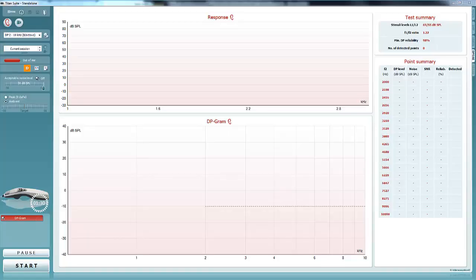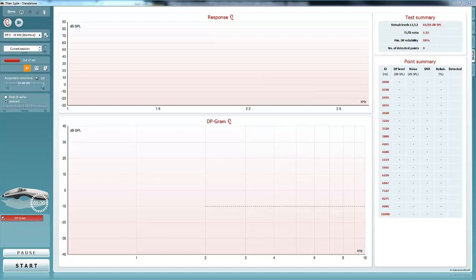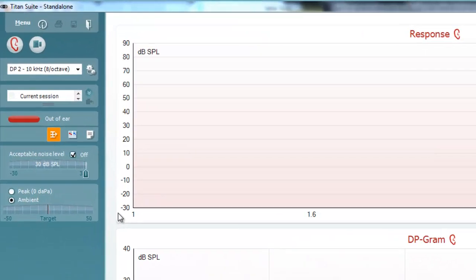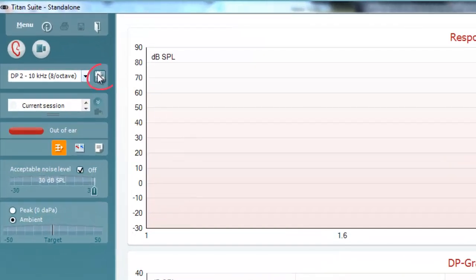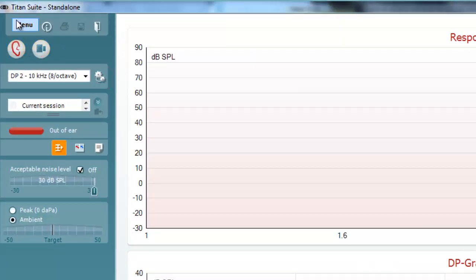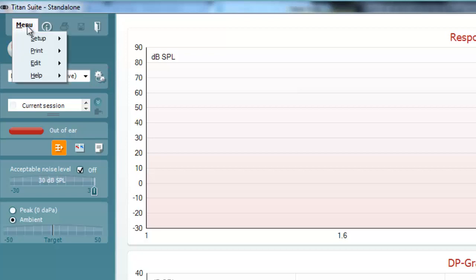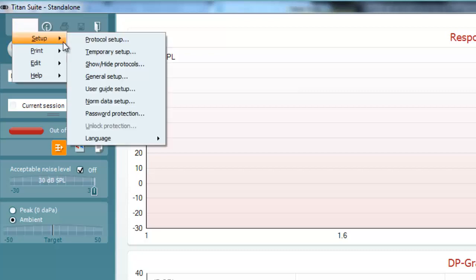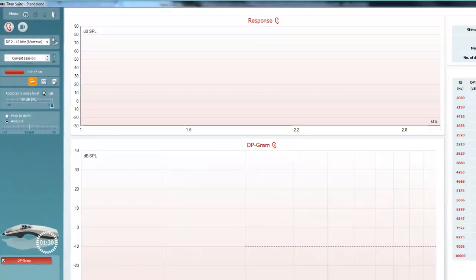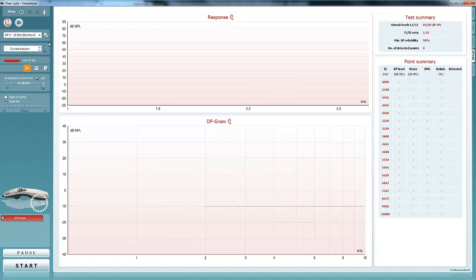An OAE measurement will only pass in the software if a measured OAE reaches a set of criteria. The OAE criteria can be changed in two ways, either temporarily using the temporary settings button or permanently by creating a new protocol. This video quick guide will focus on temporarily changing the criteria.